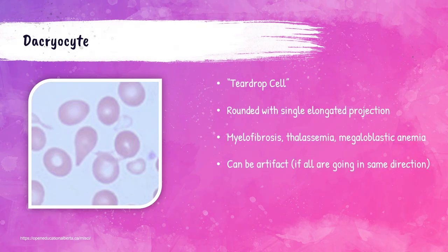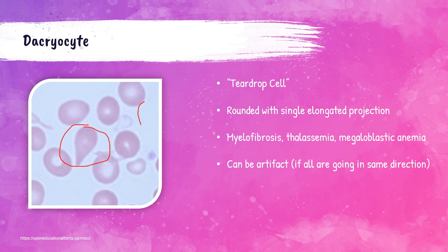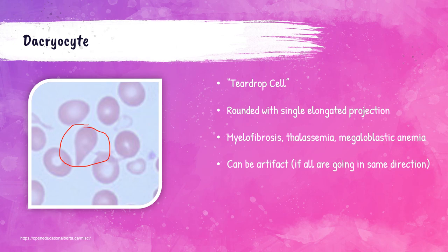Dacryocytes are also called teardrop cells — I can remember this name because there is 'cry' literally in dacryocyte, which helps me remember that's the fancy term for teardrop cells. These literally look like teardrops and can be seen in patients with myelofibrosis (a type of blood cancer), thalassemias, and megaloblastic anemias. If you're evaluating a peripheral blood smear and you see dacryocytes all going in one direction, this is likely an artifact, not true dacryocytes — the smear-making process can push red blood cells in the same direction. If they're in different locations or different directions, those are probably true dacryocytes.